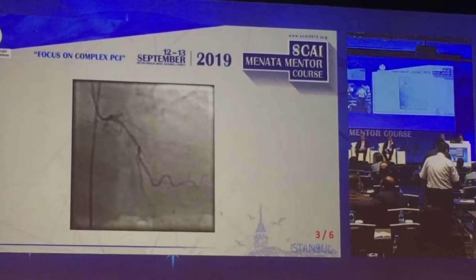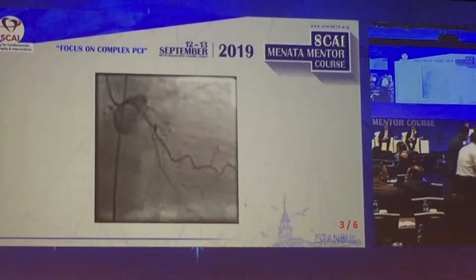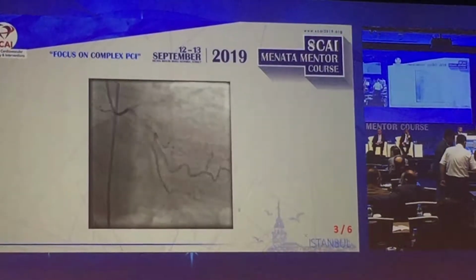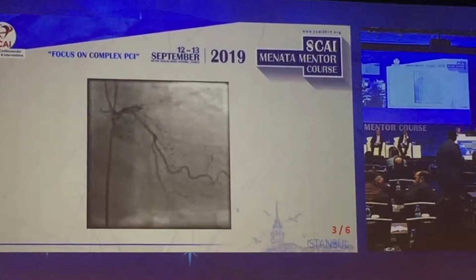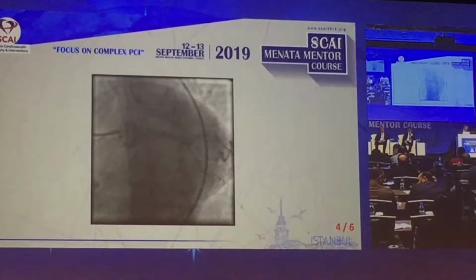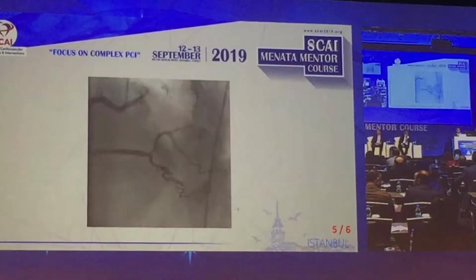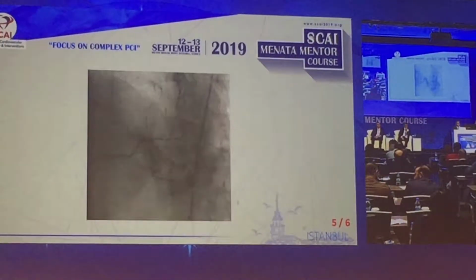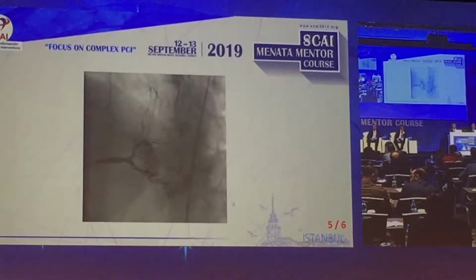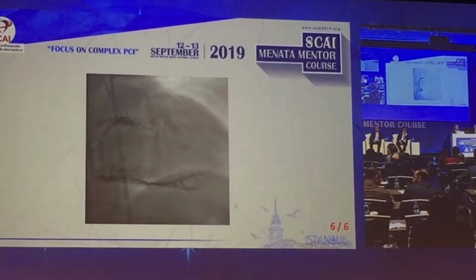There is baseline angiography, as you see. There is a stent in the circumflex, and the LAD is totally occluded 1-2 millimeters after the ostium. There is a long stent in the LAD, from another view. And there is good basal, high basal filling. There is RCA and good retrograde filling from the RCA to the LAD. Another view.